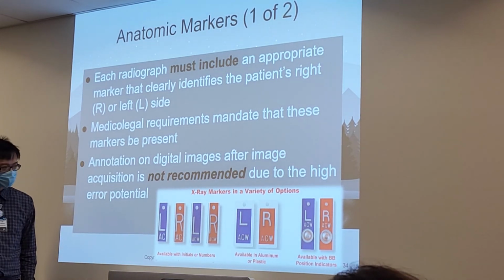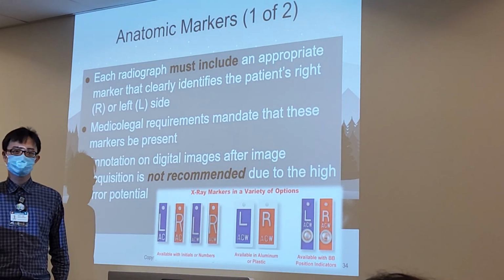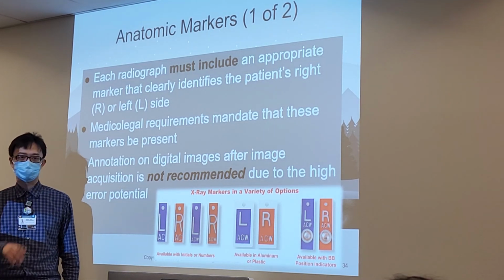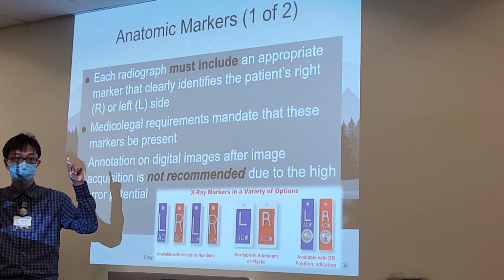Yes? For your fingers, you don't need a marker? You do need a marker, even with the fingers. Always use a marker. Besides, if you show a finger, is it the left hand or the right hand? I don't know which finger it is, especially if it's upside down.